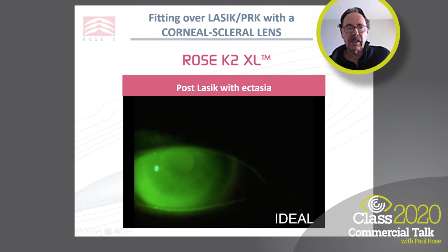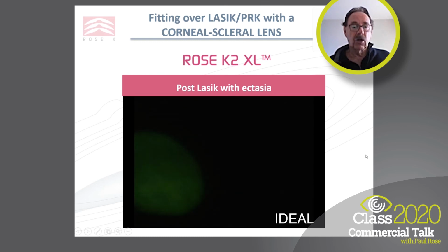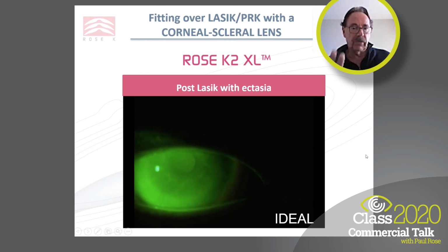So here's a post-LASIK case with ectasia, and you can see as the patient's blinking, we're getting light touch. I'm very happy with that fit. As long as I see that the touch is not there all the time, I'm very happy.